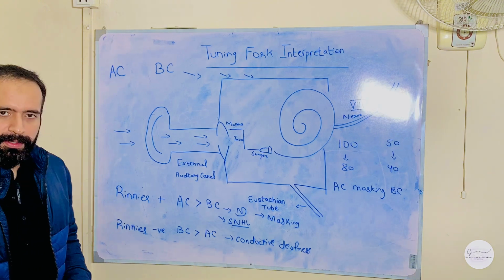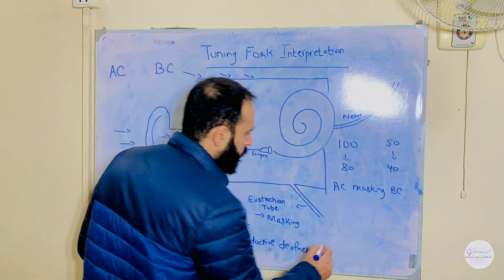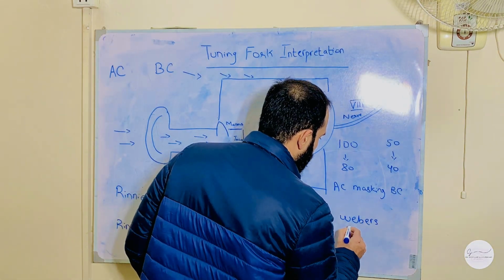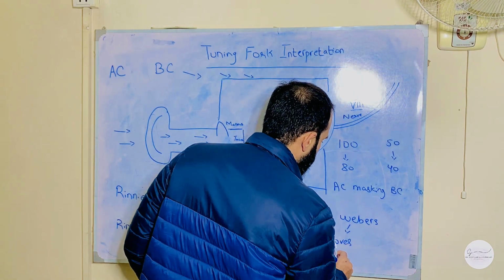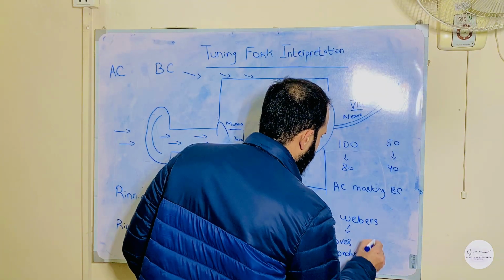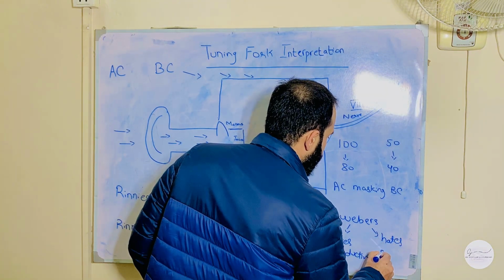The third principle that we need to learn for tuning fork is that of Weber's. I always tell my students, Weber's, it loves conductive and it hates sensorineural.